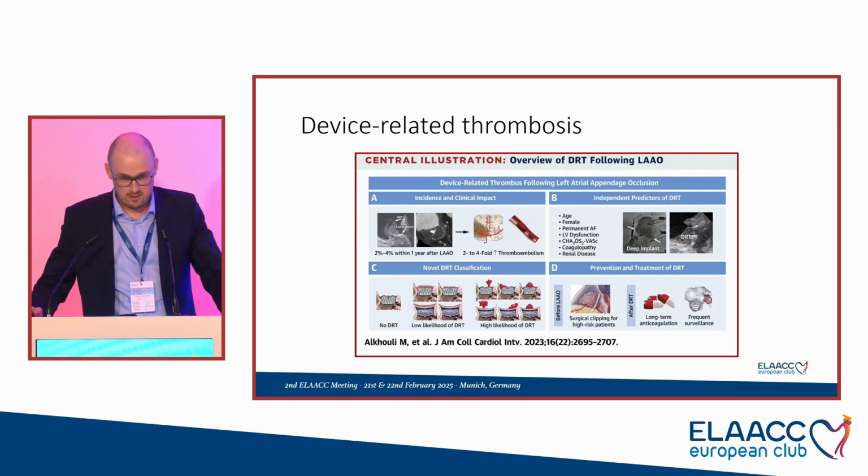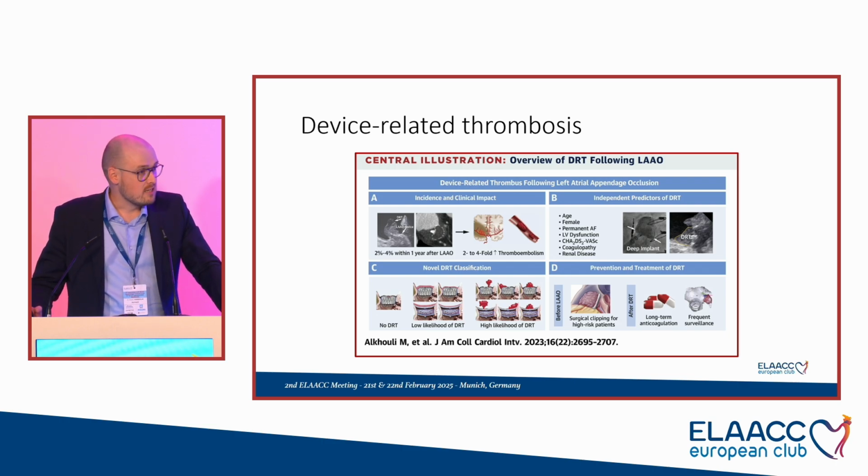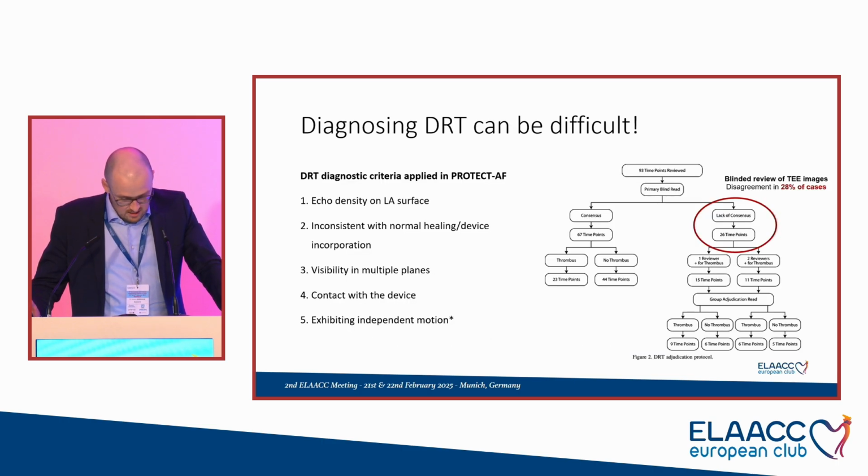So as Erik already said, DRT is associated with thromboembolism. The incidence varies across major registries and clinical trials, and probably also a bit with the modality used for diagnosing and the timing of follow-up. In my opinion, diagnosing device-related thrombosis is difficult.